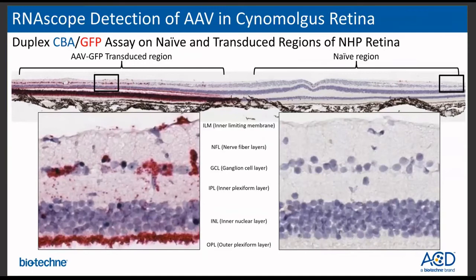So another question that might come up is that in some cells, signal is observed as blobs and in some as dots. This cannot be controlled, how much virus actually gets taken up. So sometimes you see the variety or the spectrum of dot intensity or clusters.